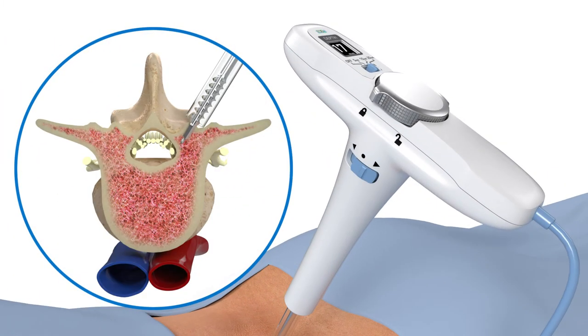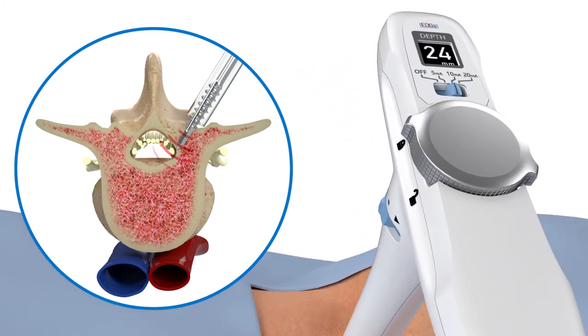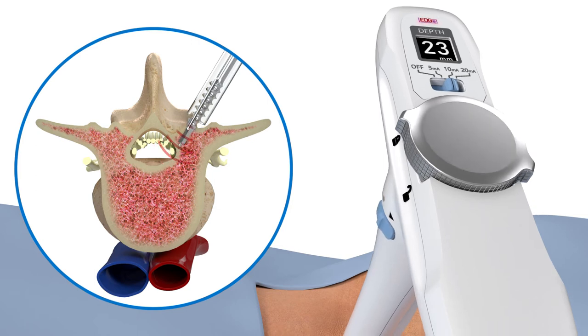As the surgeon advances the device with the ratcheting handle, if the trajectory begins to veer toward a nerve, the all-in-one tap will indicate this via a flashing red signal and audible notification. The surgeon can also adjust the amount of milliamps to further provide feedback of nerve proximity.